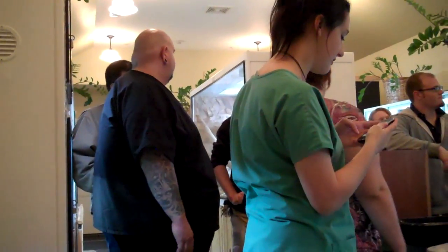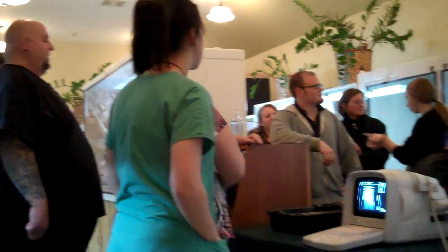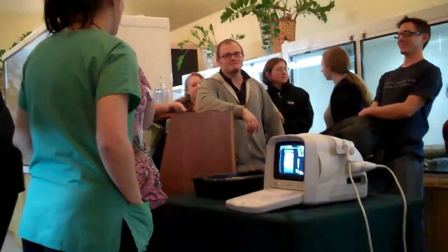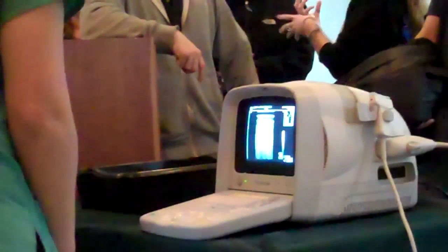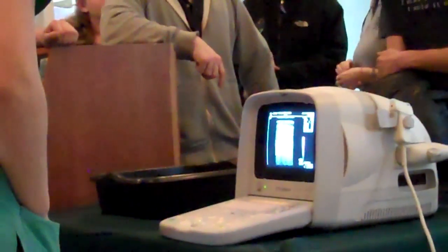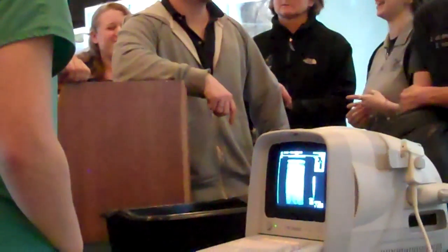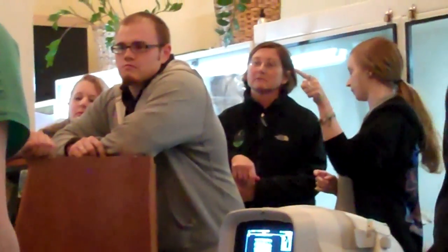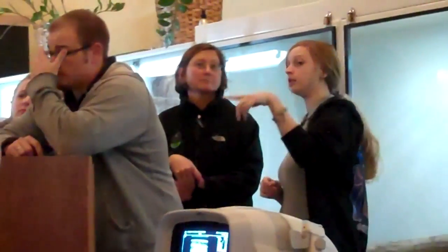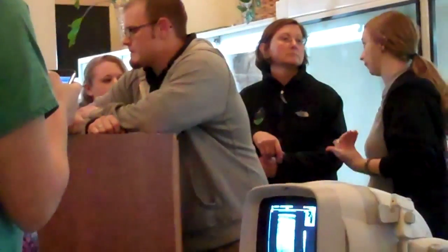Here we are sitting at the hot room inside of the Wildlife Discovery Center. There's the ultrasound machine that we are going to use to ultrasound some hots today to see if they're possibly pregnant. It's the first time that Area 51 has done a hot. So Gavin and Rob Carmichael are going to help probe the hots and get them all set up, and then Elizabeth and Mike are going to go to work with the machine.